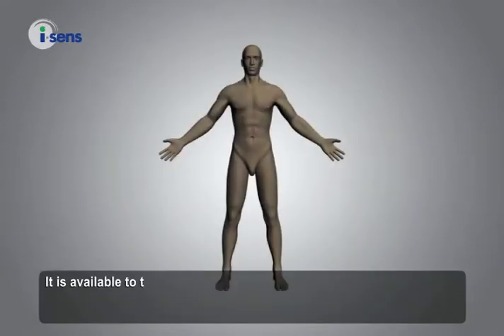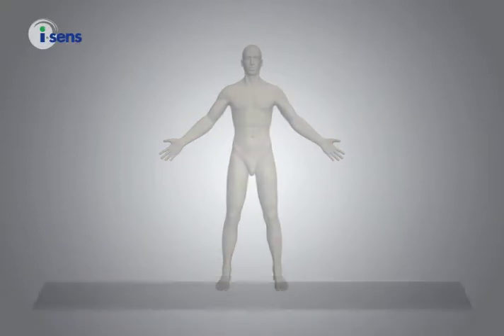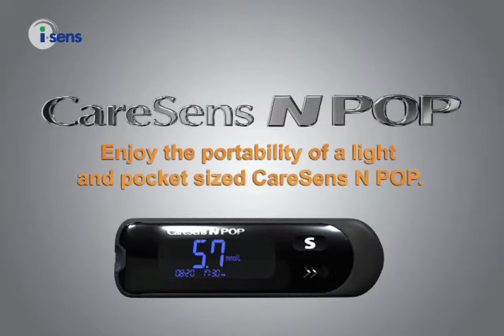It is available to test your blood glucose from alternative sites of the body. Enjoy the portability of the light and pocket-sized CareSense NPOP.